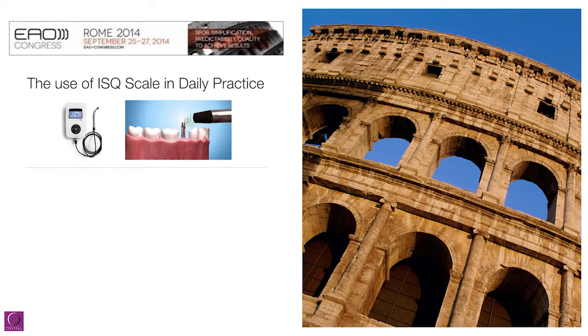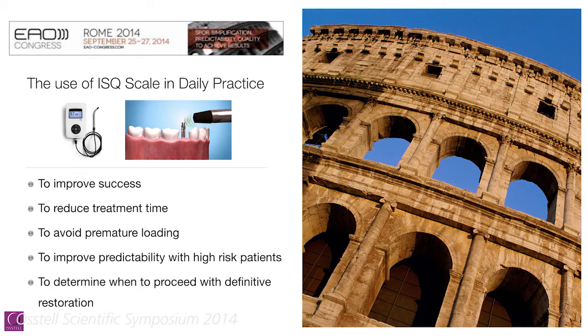It's my job to show you how the ISQ scale is used in daily practice. I use it to improve my success. I use it to reduce the treatment time for my patients. I use it to avoid premature loading.